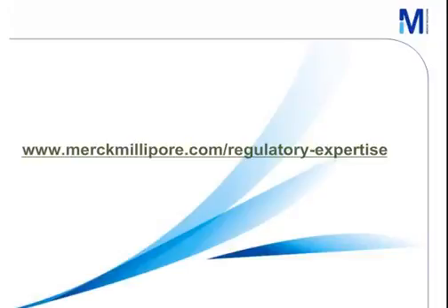The maximum storage would vary for different kinds of media, such as hygroscopic media, e.g. MCP, Clostridium agar. Is this right? Yes, that is absolutely correct. Thank you very much, first of all, for this question. It's really a practical question for the lab.